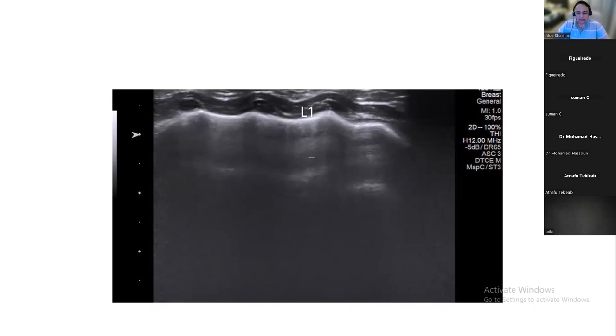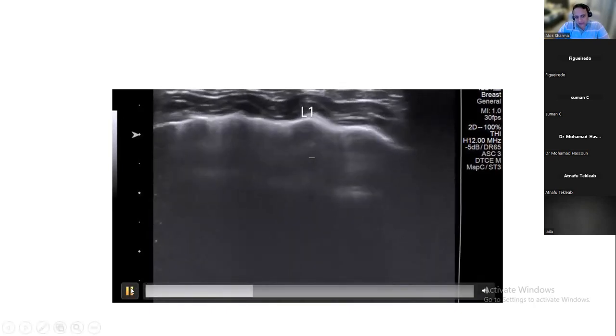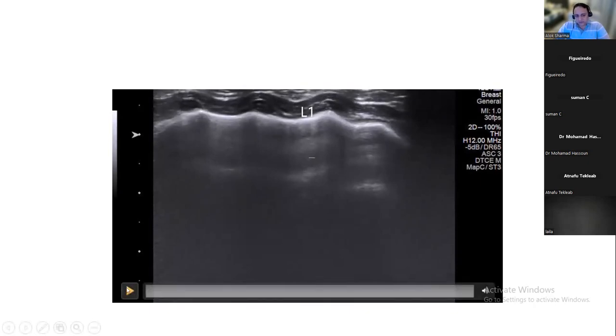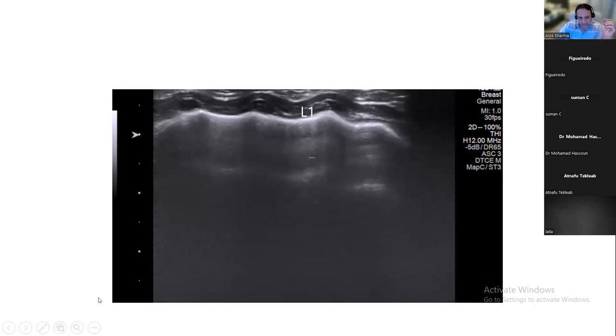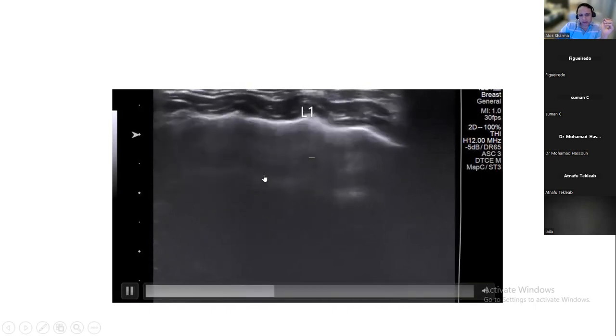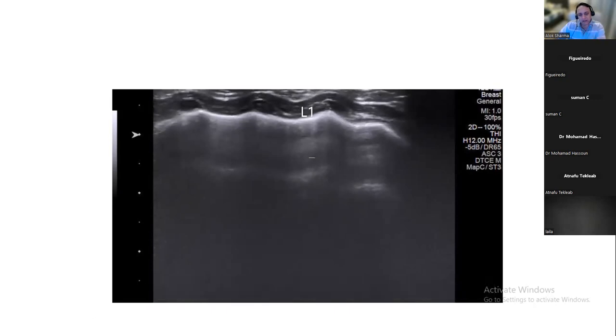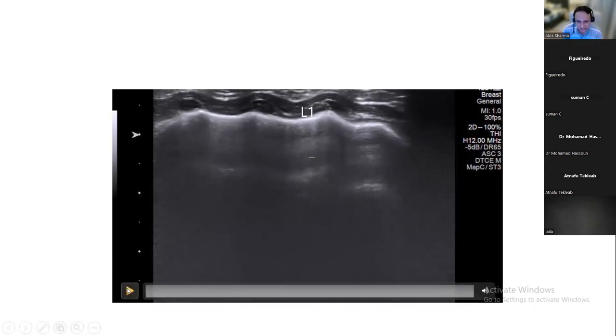I apologize. The one thing I'd say is your marker is at the pleural line, the pleural margin. I can see good sliding. What you might do is drop the frequency to 8 to see if you get a little bit more delineation from the deeper part of the lung. And the other thing is, if you want slightly better quality and better A-lines, because I know you're looking at 2, 3, 4, 5 centimeters of depth, you can reduce your depth a little bit to see the superficial areas of the lung better, and then increase the depth and use a slightly lower frequency. It's worth having a play with those settings and just increasing your gain settings next time.